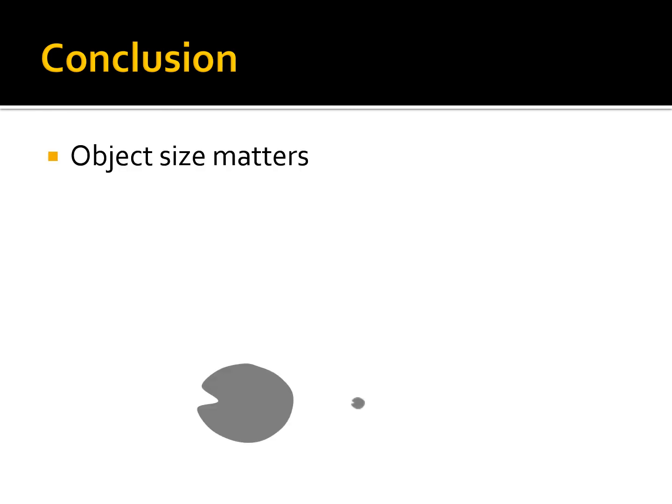As we saw in the Fundamentals of Detail video, object image distance, source to image distance, and focal spot size affect detail. But also an object's size relative to the pixels recording it also makes a difference in its visibility. An object's actual size governs the number of pixels that represent it in the final image. The more pixels that make up an image, the more likely and more accurately it will be recorded and displayed.